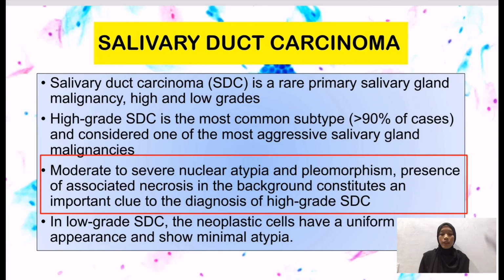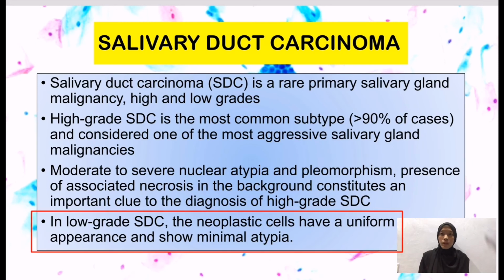Presence of associated necrosis in the background constitutes an important clue to the diagnosis of high-grade SDC. In low-grade SDC, the neoplastic cells have a uniform appearance and show minimal atypia.